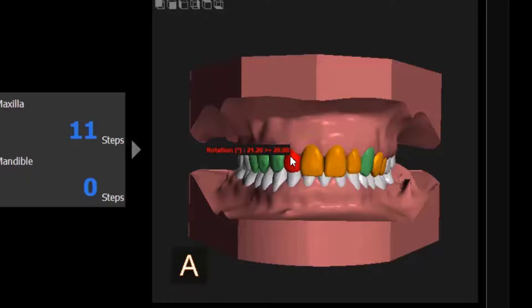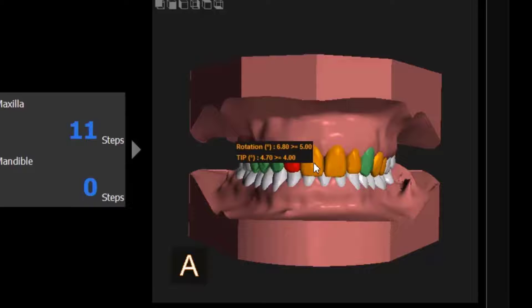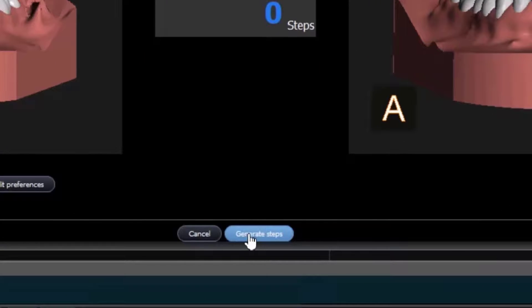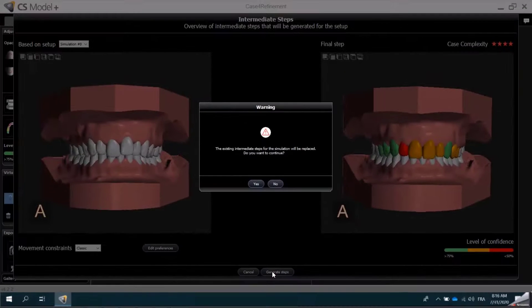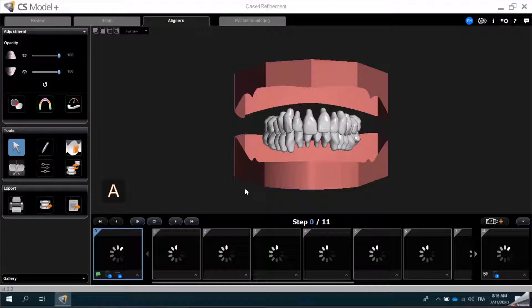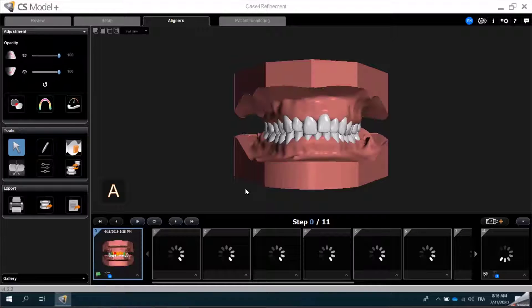I can also hover over each tooth and a window will be displayed providing the rotation and translation details. Once I have confirmed that I would like to proceed with this proposed aligner treatment, I will select Generate Steps to generate the digital models of each of the aligner steps in the treatment plan. We will now go to the aligner tab and CS Model Plus will automatically perform the calculation.